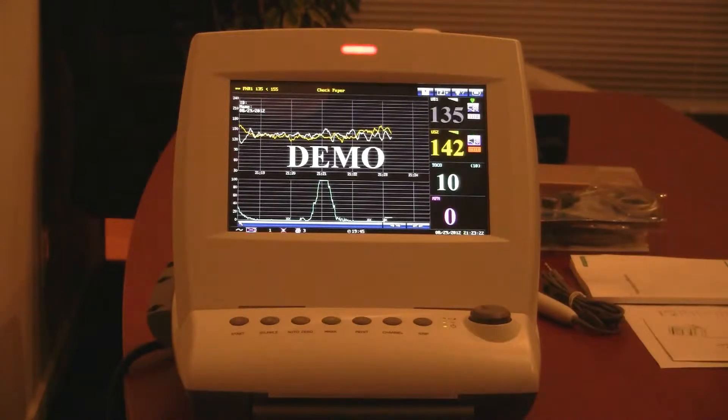That data can very easily be transferred with our Insight software that comes standard with the unit, where it can then be backed up and archived on a server. This machine is also compatible with our central nursing station for a larger facility application, which will support up to a 32-bed facility.